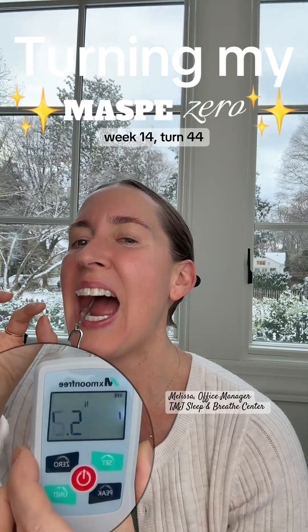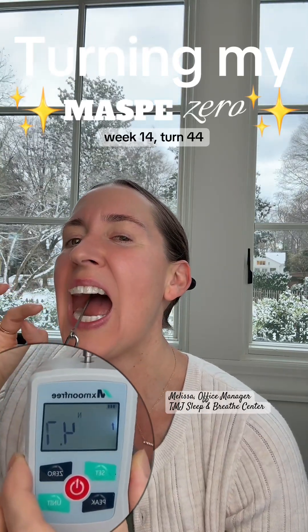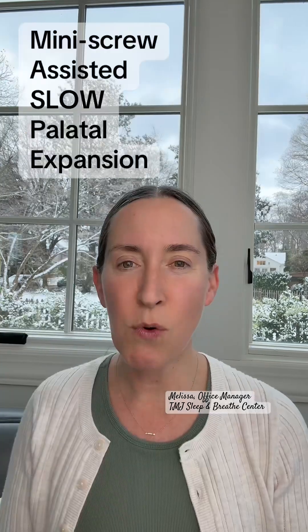Starting week 14 of expansion, let's talk about why my MARPE doesn't attach to my teeth. That's week 14, turn 44.